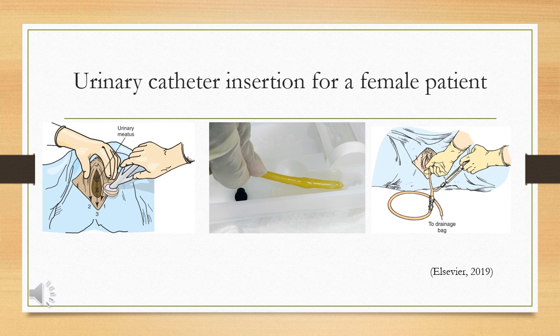Insert the indwelling catheter and ask the patient to bear down gently as if to void, and slowly insert the catheter through the urethral meatus. Advance the catheter until urine flows through the tubing, and after visual confirmation of the urine in the tubing, continue to advance the catheter. Once you have reached this point, go ahead and inflate the balloon per manufacturer guidance.